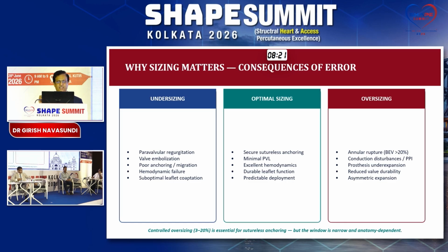Then what is ideal is optimal sizing. This secures sutureless complete anchoring of the TAVR valve, minimum or no paravalvular leak, excellent hemodynamics with minimum gradients and no leak, durable leaflet function and predictable deployment. This is what you want. So focus on optimal sizing.